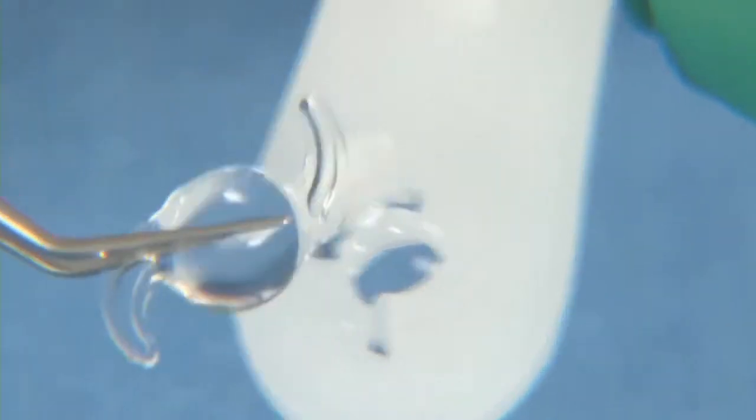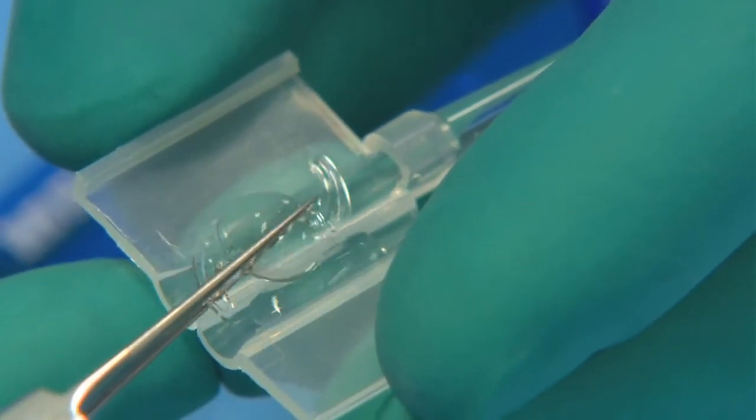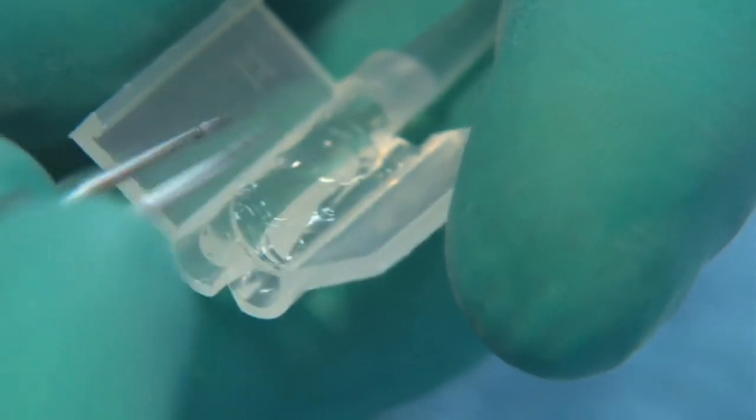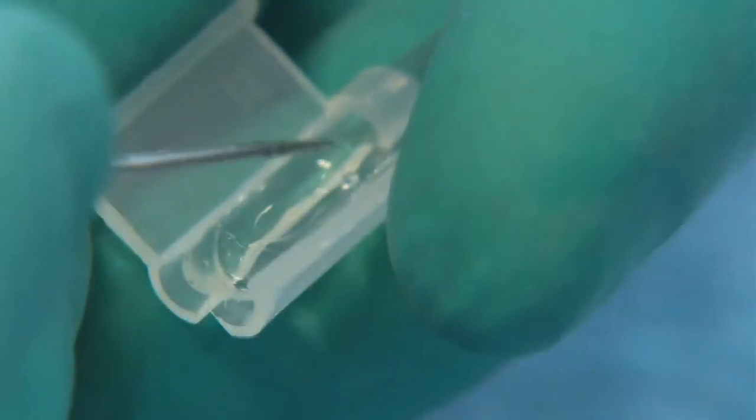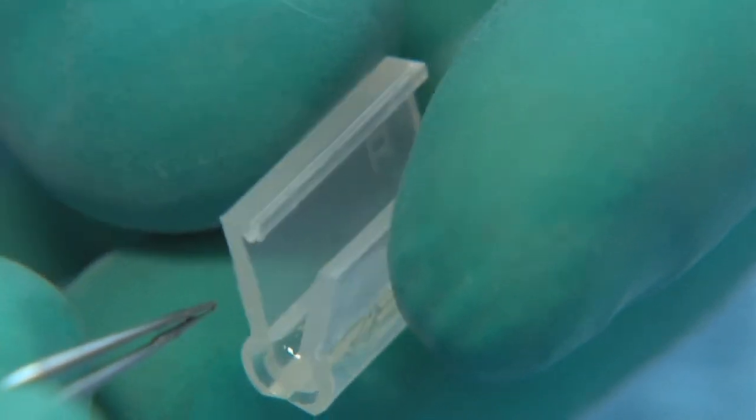Loading a biflex lens is very simple. You just place it in the middle of the cartridge in its Z position. Press gently and fold back the side struts near the optics without overlapping them. This results in perfect positioning within the closed cartridge.